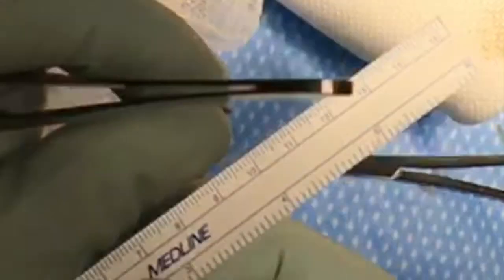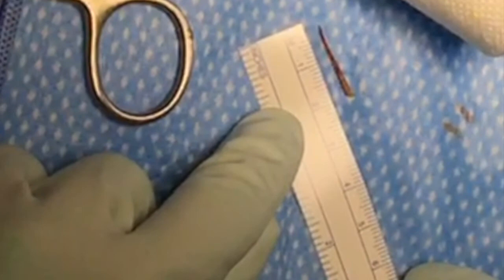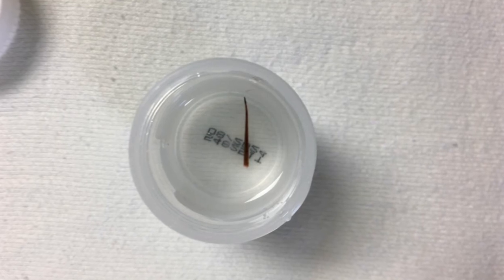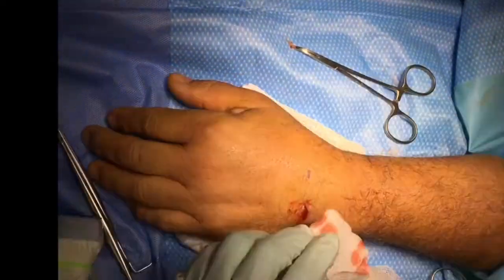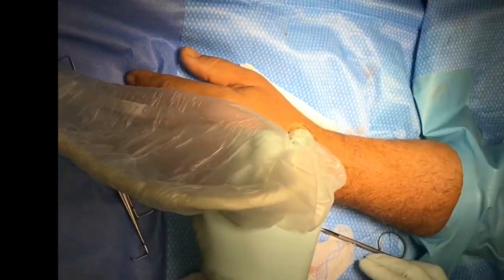We then measure the foreign body to confirm that it's close to the size found on ultrasound — this one measured about two centimeters in length. This is a more close-up photo of it in formalin. You can see it is just a typical thorn. We then further dissect to make sure there's no retained foreign body, and perform a second ultrasound demonstrating that there is no retained foreign body.